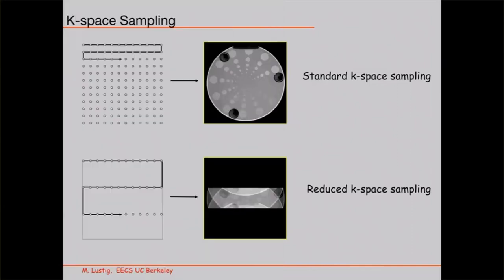So yeah, where were we? Let's talk about k-space sampling now. If you collect the full k-space, if you just do standard k-space sampling, you collect all the measurements and then compute an inverse Fourier transform, you get an image. But if I skip some of the phase encodes, then my image is going to be overlapped, like taking a pita bread and just folding it. This is what you get, except that it's additive.